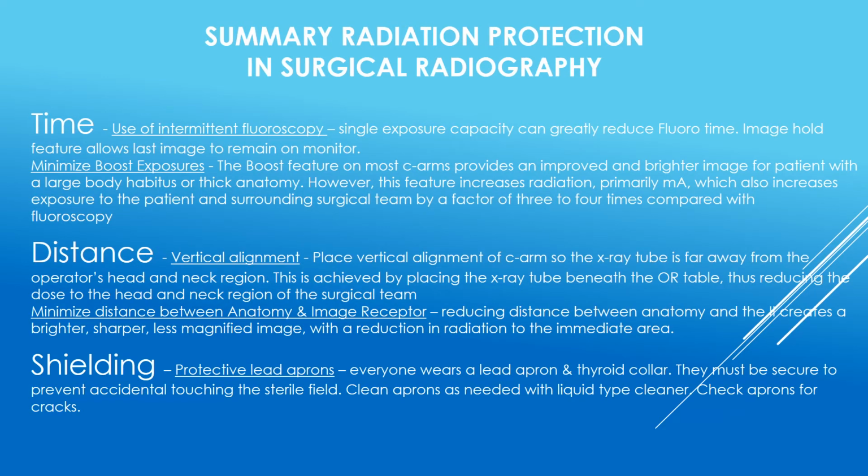Summary of radiation protection in the surgical radiography. Time. The use of intermittent fluoro, a single exposure capacity, can greatly reduce fluoro time. Image hold feature allows the last image to remain on the monitor.